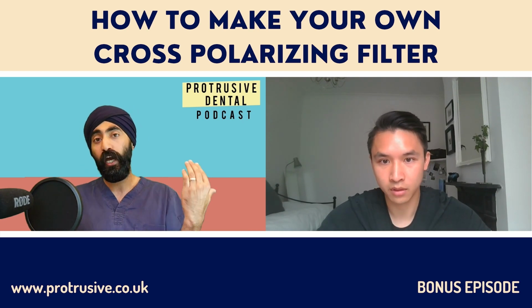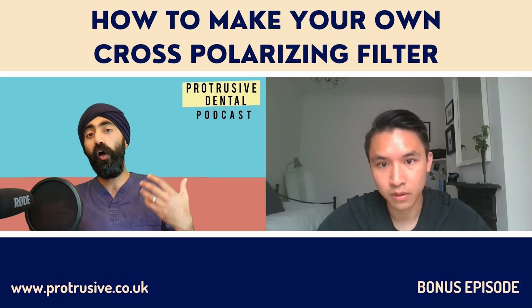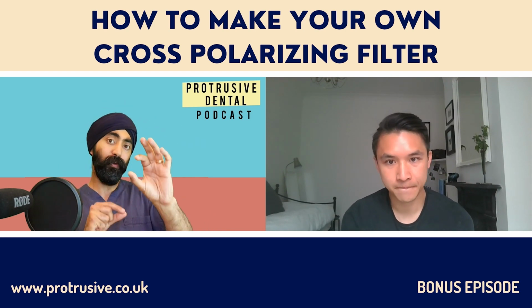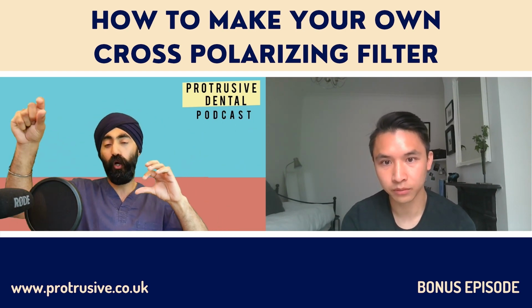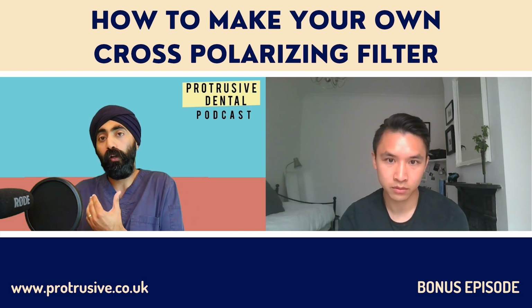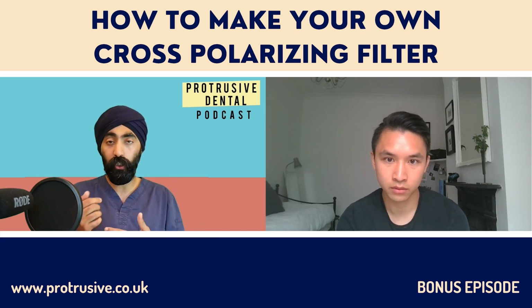So by using a cross-polarizing filter, you get all the detail from a photograph without all that horrible flash, and that's why these composite buttons that you place, you know, an A2 over here, an A1 over here, etc., to see, okay, and you obviously cure it, what shade is most likely going to match the adjacent tooth, etc. That's how you're using it.